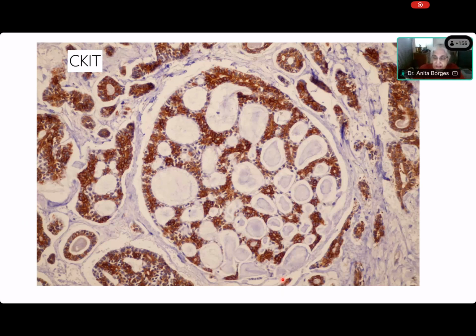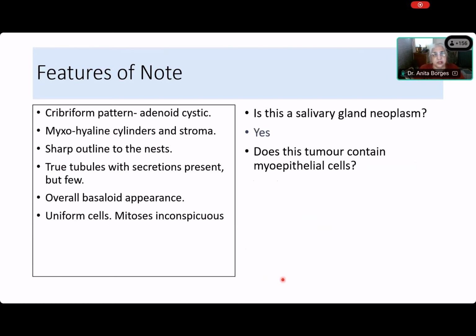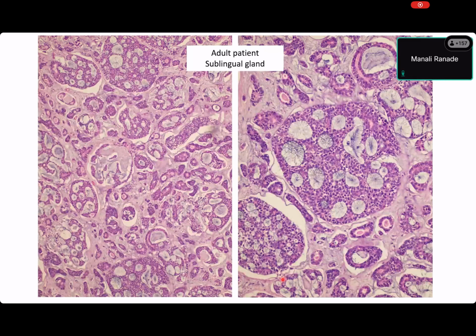Can somebody please ask that question that somebody asked about where are the luminal cells? It was an interesting question. In cribriform areas, abluminal cells are inside and luminal cells are outside. So why is that like that? There may be no luminal cells at all. This is just a solid group of myoepithelial cells.